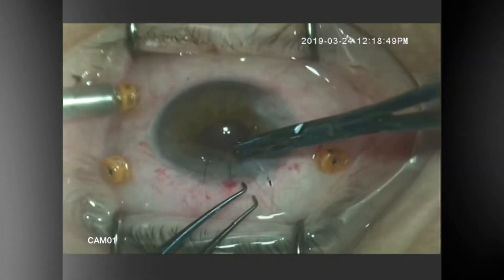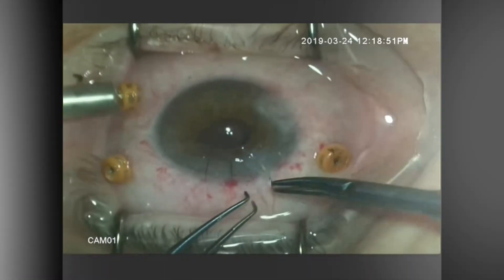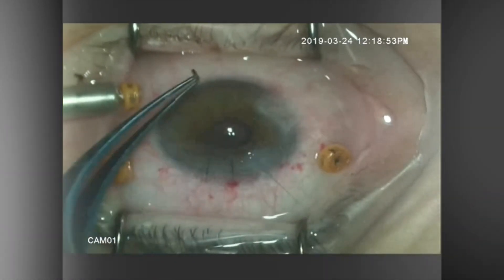The wound will then be sutured, and that will be the end of the case.